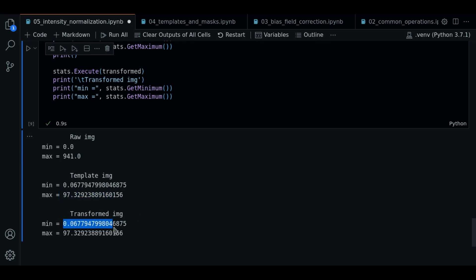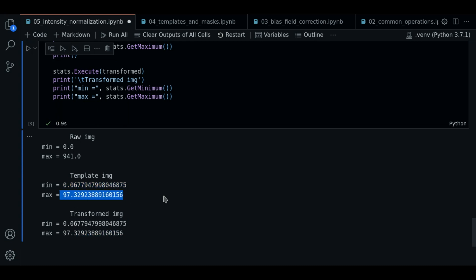And if you notice, now the transformed image has the same values as the template image. So this is a way to confirm that the distribution have changed.